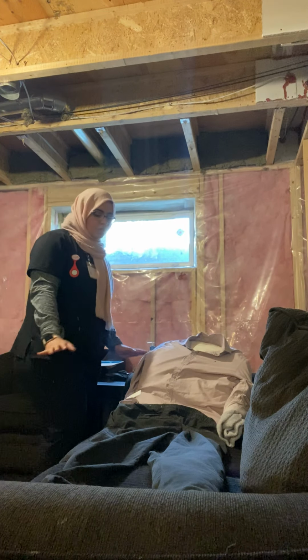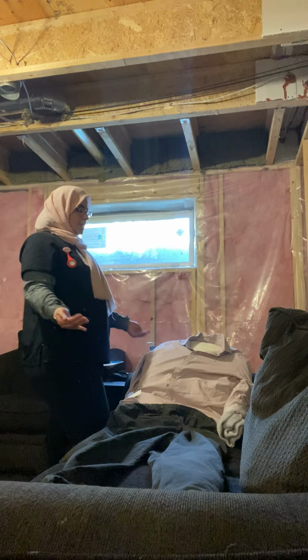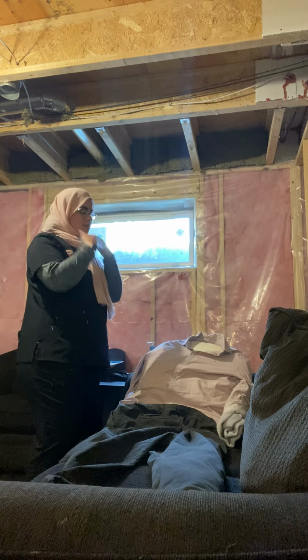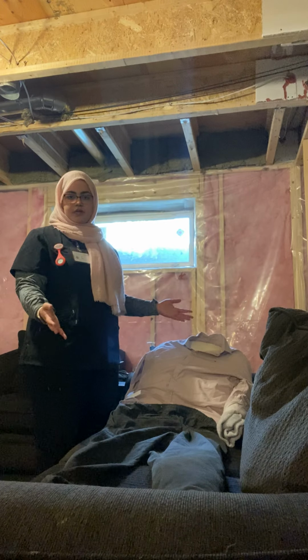Okay, perfect. Is it okay if I move the bed to my working height? You're just gonna feel a little bit movement. I'm just moving it to my working height so that I'm not bending down. I'm gonna move one side rail down so that nothing is in my way. And then I'm gonna take vital signs. So I've done that. I've taken all the vital signs that I need.